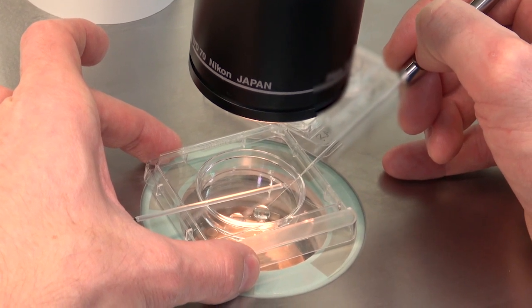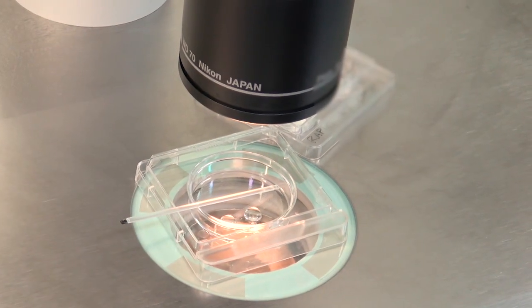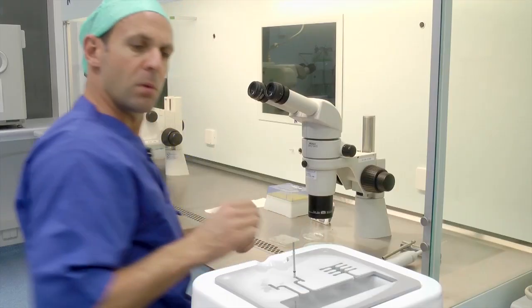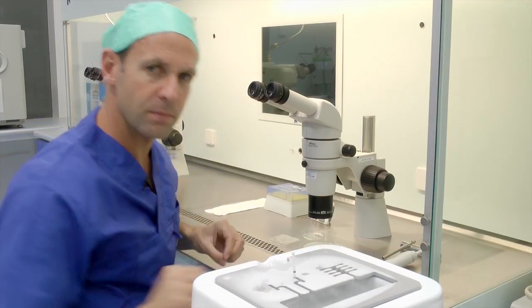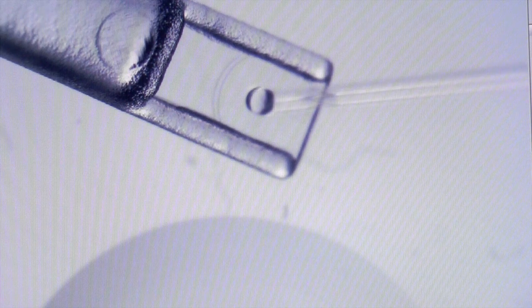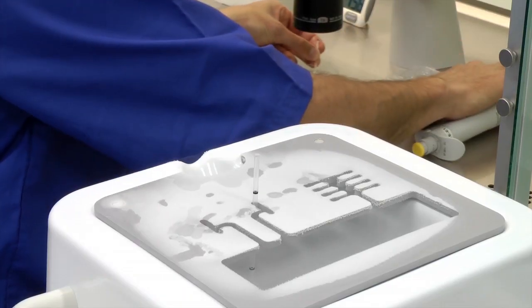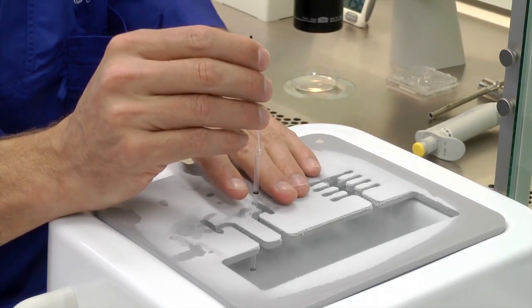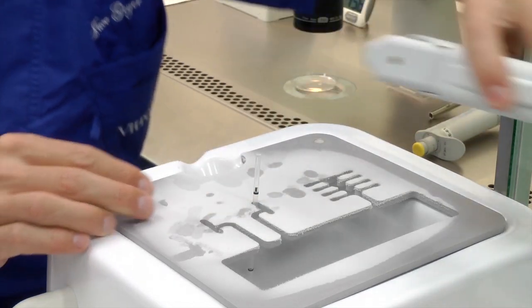The total exposure time from entering the first droplet to vitrification should be between 25 and 35 seconds. Remove the metal rod from the straw in preparation for vitrification. Collect the oocytes and keep them as close as possible together at the tip of the pipette. Load the oocytes in the hole of the RapidEye without overfilling or underfilling. Immediately place the RapidEye inside the pre-cooled straw and simultaneously hold your hand above to prevent the RapidEye from accidentally popping out.